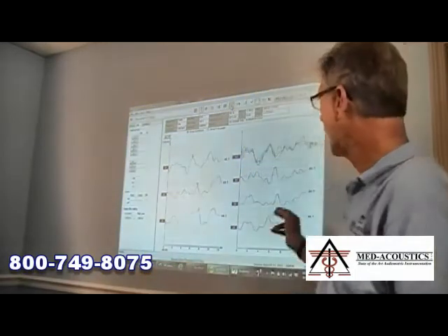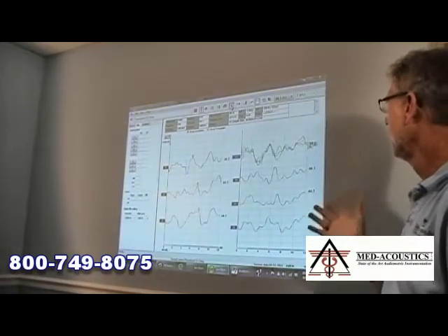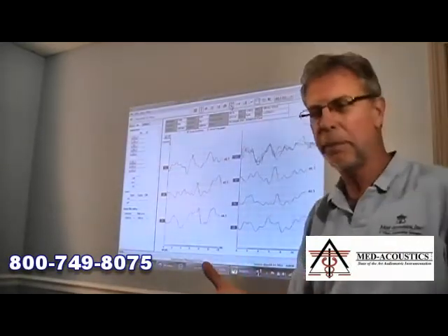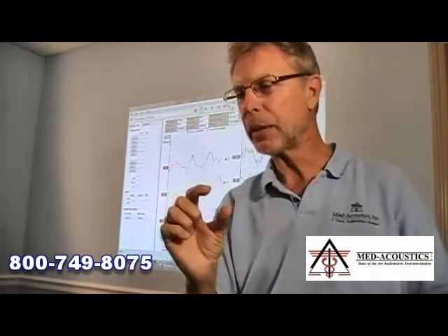But watch this. I've chosen that particular waveform, and I'm going to hit this icon that says AB. So now I have my A and B replications superimposed on it. And so I can see without any more information that this is indeed replicated. And I didn't actually have to run that replication because both A and B were acquired simultaneously as I had acquired this waveform, and they're available. The waveform that I see is the average of both.